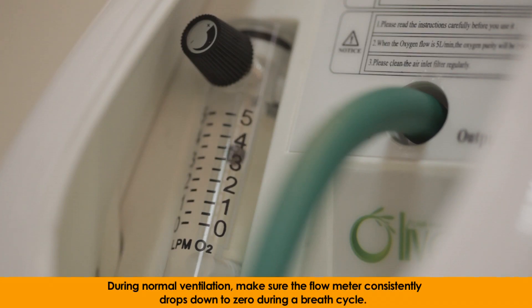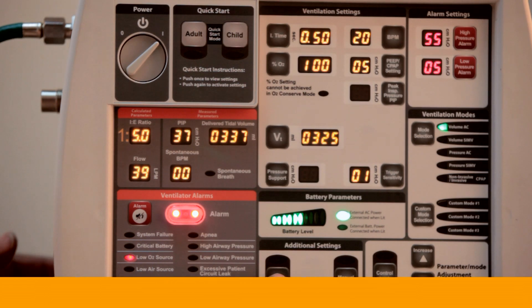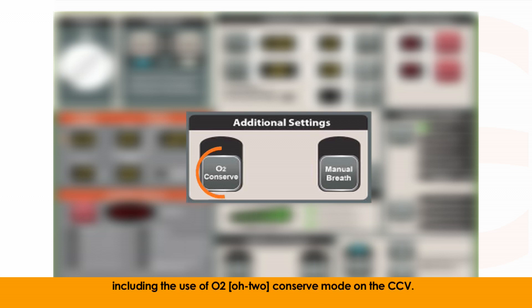During normal ventilation, make sure the flow meter consistently drops down to zero during a breath cycle. This indicates that the reservoir is filling completely. During session two, part four, we will discuss low flow sources in more depth, including the use of O2-conserve mode on the CCV.